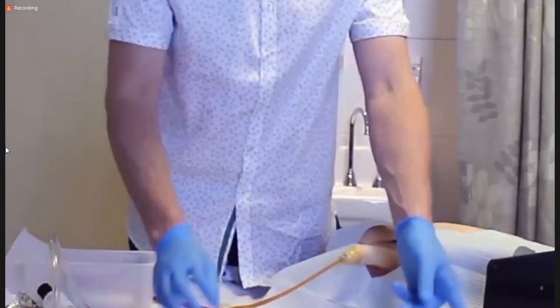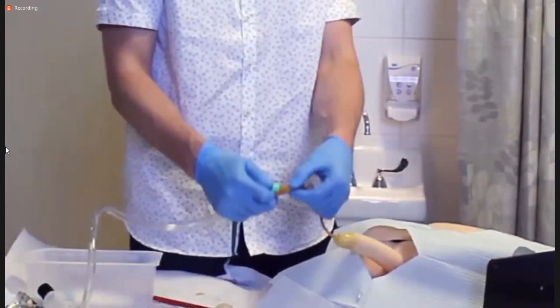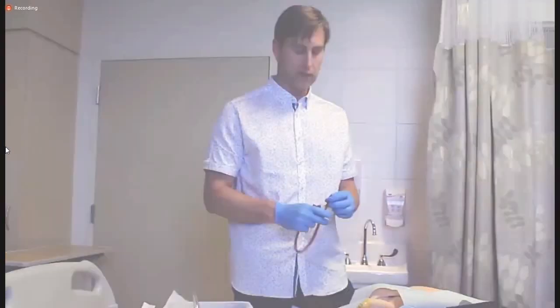If the catheter doesn't go very far in before you hit a blockage, you may want to use a very small catheter, like a 14 French. In other cases, if there's a bit of bleeding from the catheter being removed forcibly, placing another catheter is usually no big deal. So in summary, a urinary catheter is an important part of a doctor's job, at least I think, and I think it's an important skill for every healthcare professional.